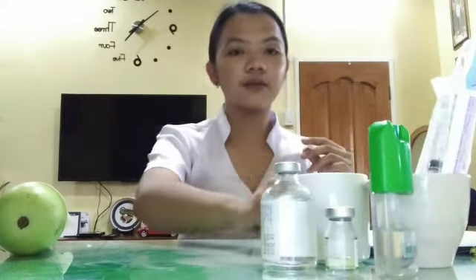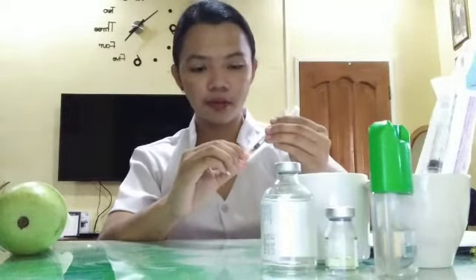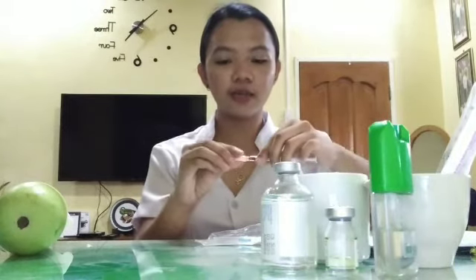So after that, we will pin, cap, and then we will change the needle into gauge 25.